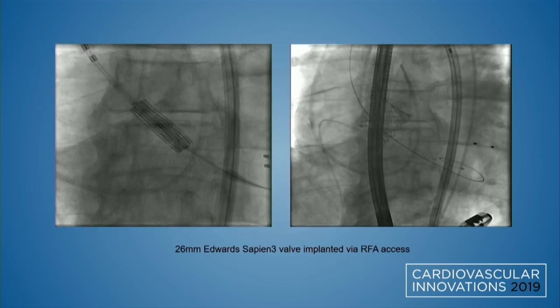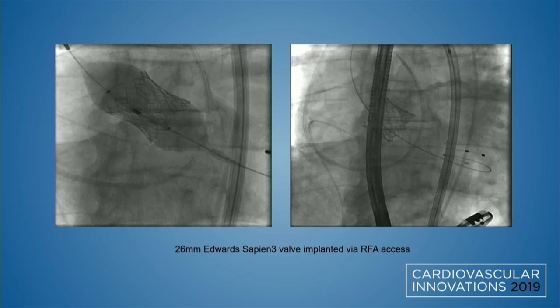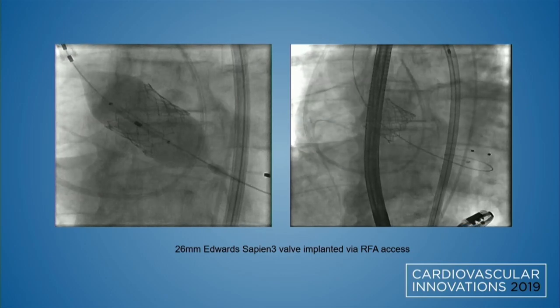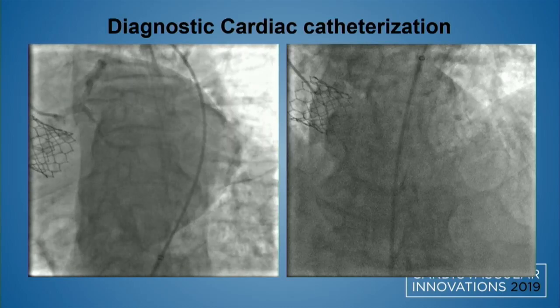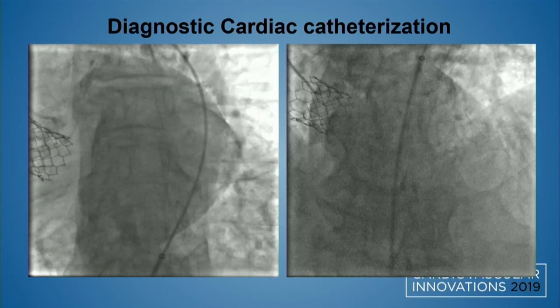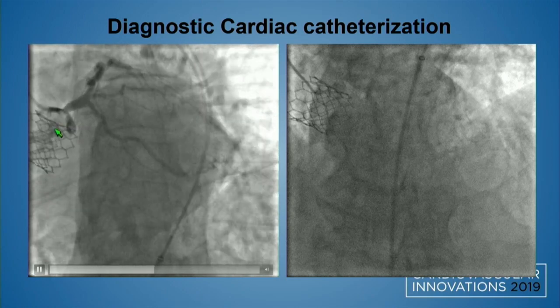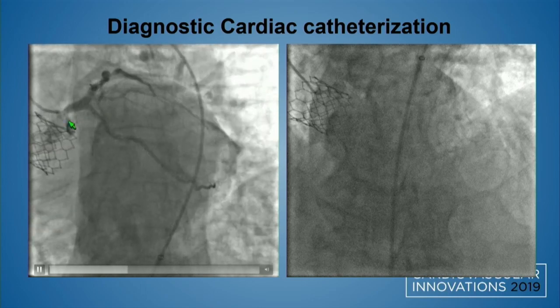I'll quickly go through this case. It's an 80-year-old man who's post-TAVR. You can see that was a TAVR implantation. The left fills normally, and he was having a lot of angina, and so we did a diagnostic. You can see that, as I mentioned, the bulkiness and calcification of the leaflet is an important factor when you're doing PCI in these patients.